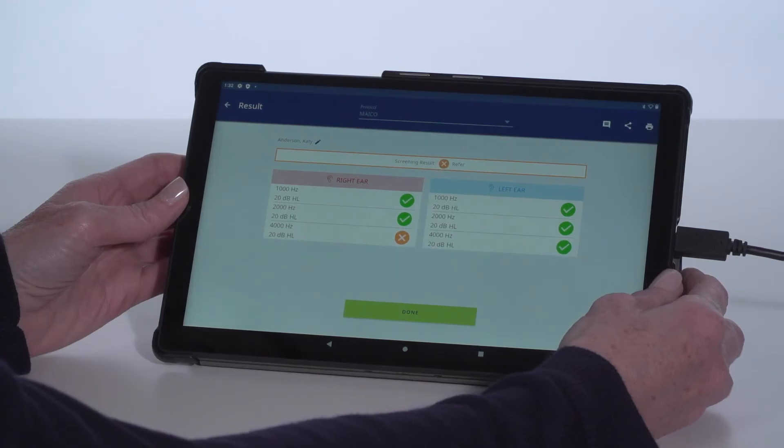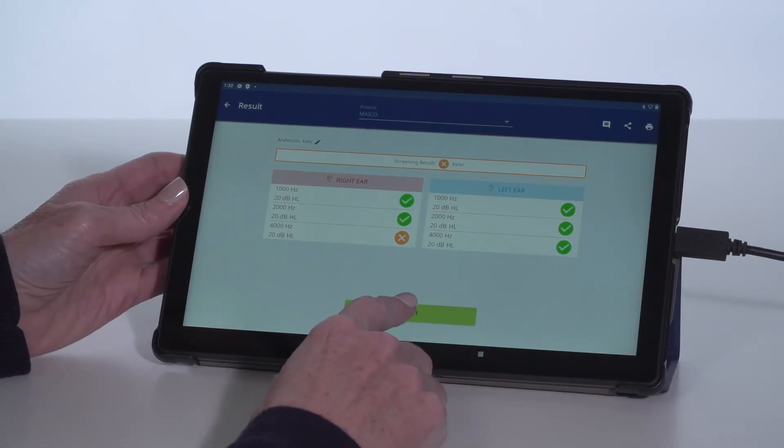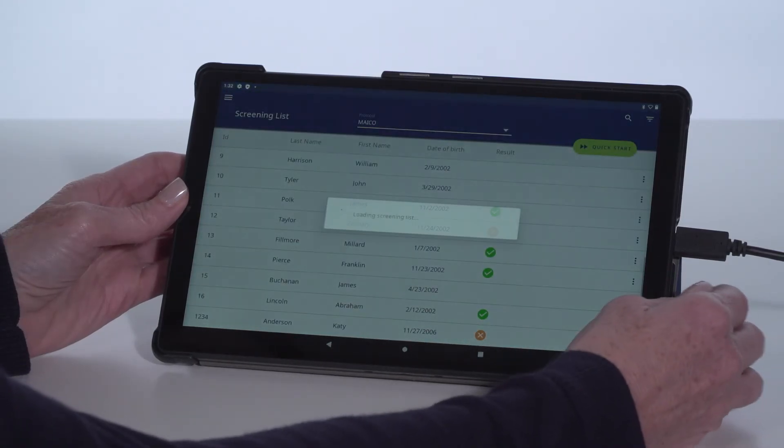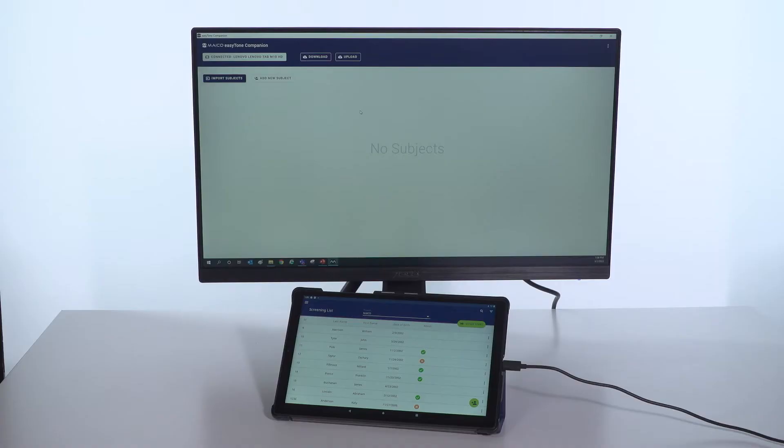For those using the Screening List mode, returning to the home screen will display the results beside the subject's name.